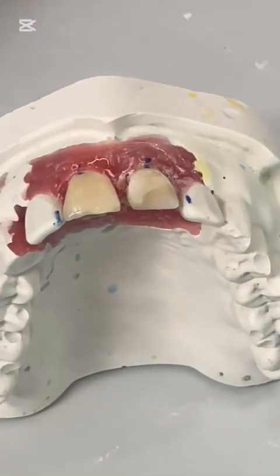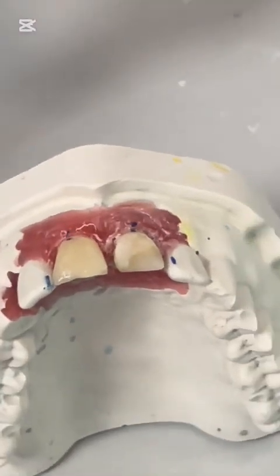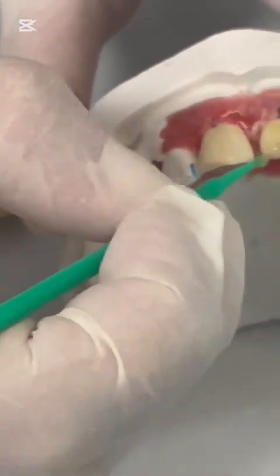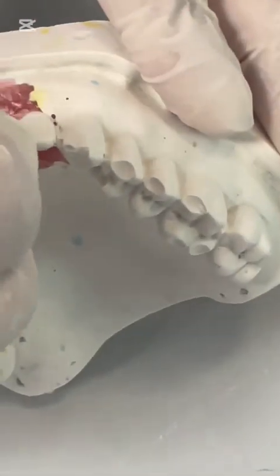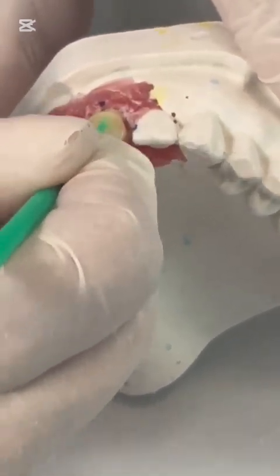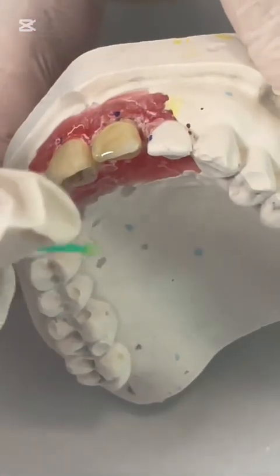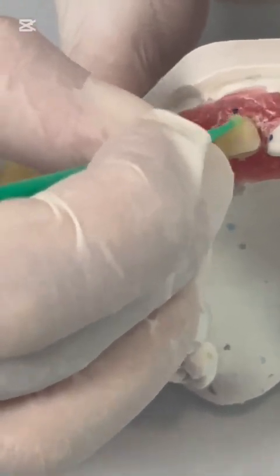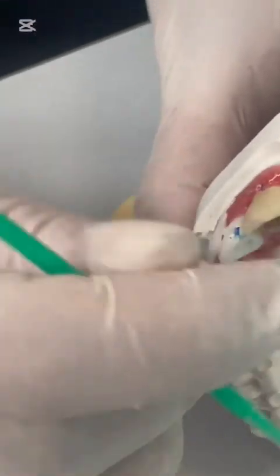Okay, the other tooth. Professor, I just have a normal question. If it's not perfectly made, it wouldn't matter because I'm going to cover it up, right? If the tooth is not perfectly beveled and lightened, I will cover it. Yes, I will cover it, and I can even change the shape by veneering with composite. You can change the shape. You can do anything you want.